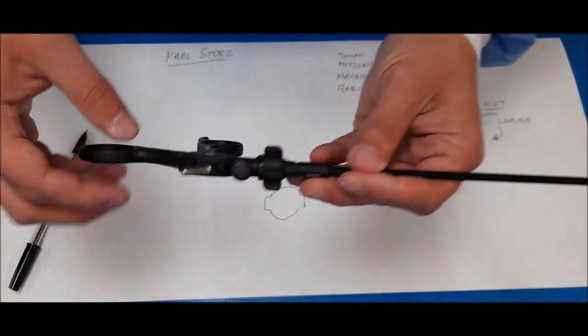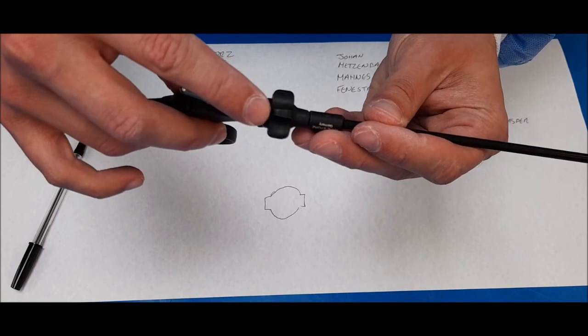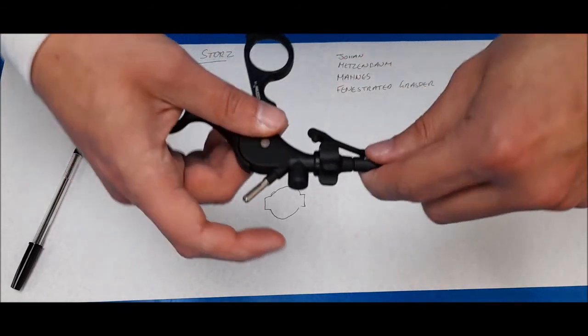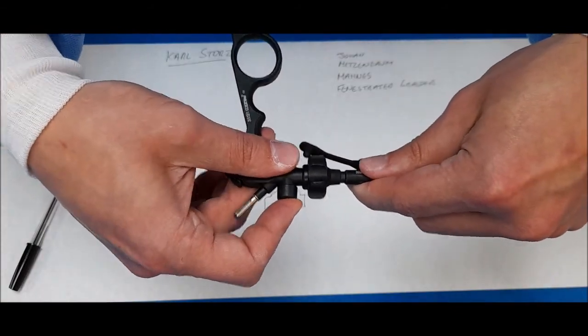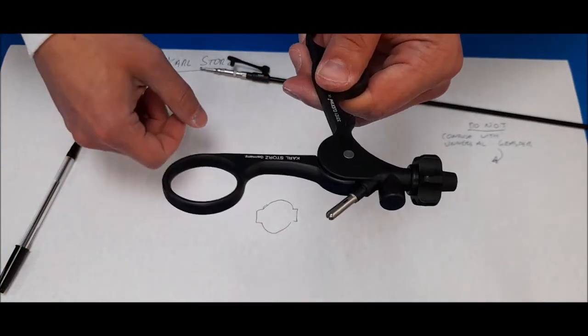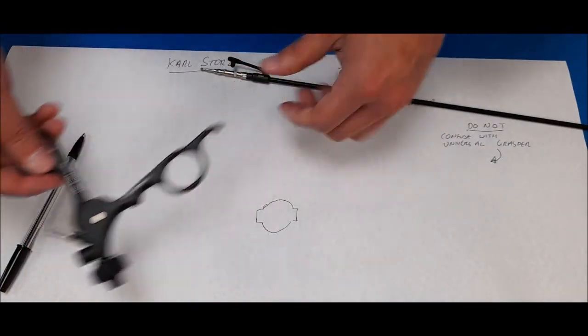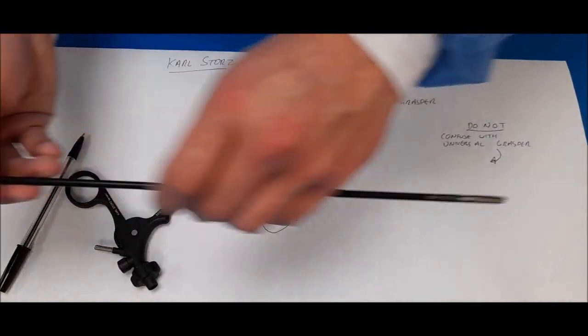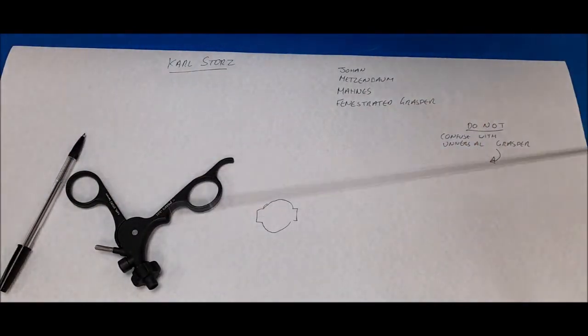To disassemble, you just press this button and pull the sheath out. Again, the handle adjusts itself to allow release. Then it is just as simple as rotating and pulling out.